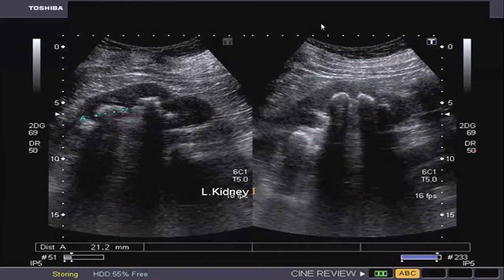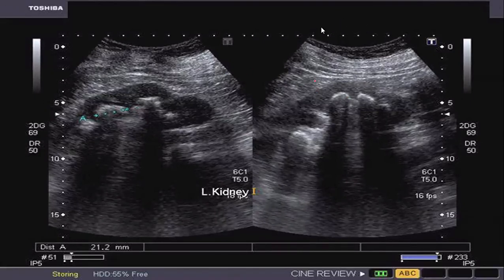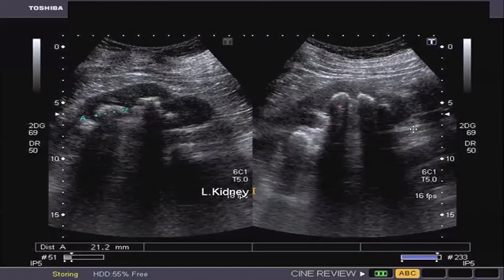So this is the one. Then on ultrasound, Dr. Alcover, are you there? Yes, Doc, I'm here. And other doctors, this is a Staghorn on ultrasound. Doc, I find it difficult to understand because in this one, I can see well. This is the pelvis, this is the major calyx, the minor. But here, I find it confusing because it is being obscured by the shadow.